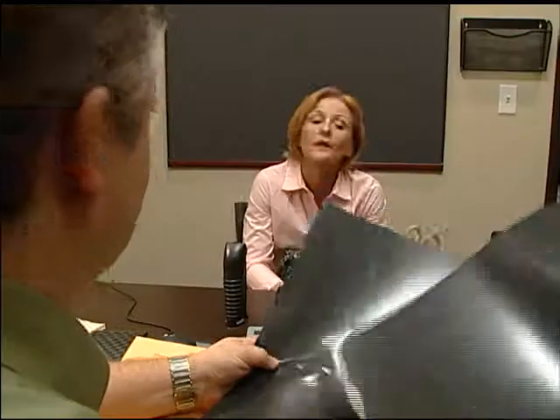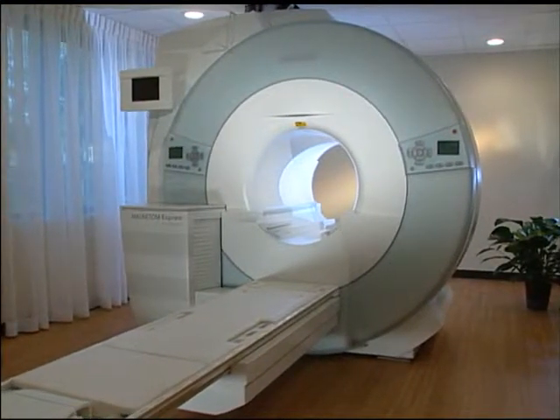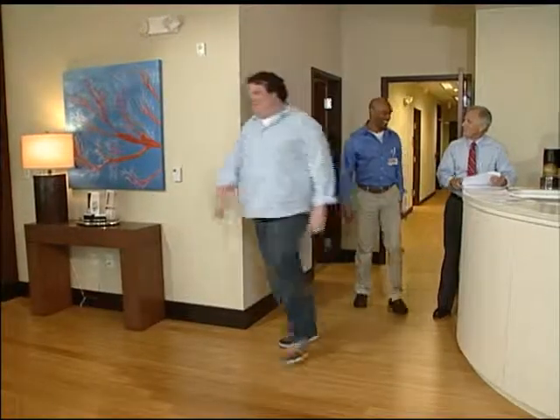Once complete, your magnetic resonance images will be processed and sent to your physician, who will discuss the results with you. Hopefully, spending these few minutes learning about magnetic resonance imaging has prepared you for your examination. However, should you have any questions, your physician or the imaging professionals at the MRI facility will be happy to answer them for you. So relax and have a good exam.